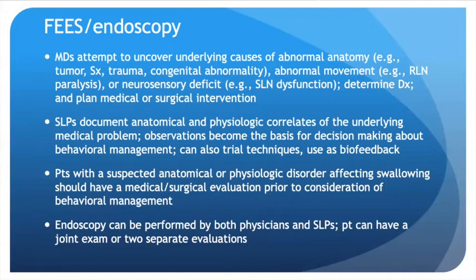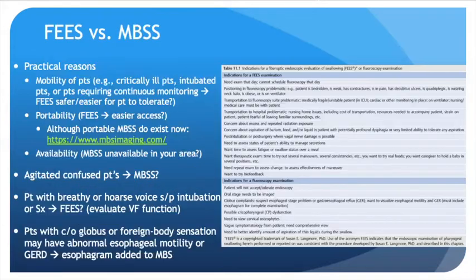So observations become the basis. Our functional observations then become the basis for decision-making about behavioral management. And we can also trial various techniques such as biofeedback during the exam. Patients with a suspected anatomical or physiological disorder affecting swallowing should have a medical surgical evaluation prior to consideration of behavioral management, of course. So we're always collaborating with doctors. Endoscopy can be performed by both physicians and SLPs, and the patient can have a joint exam or two separate evaluations. Now, FEES versus modified barium swallow studies.